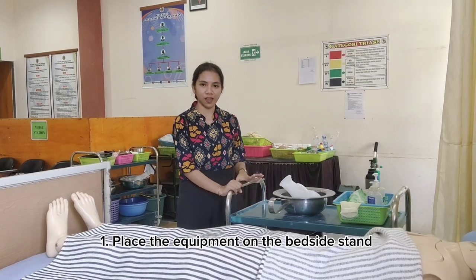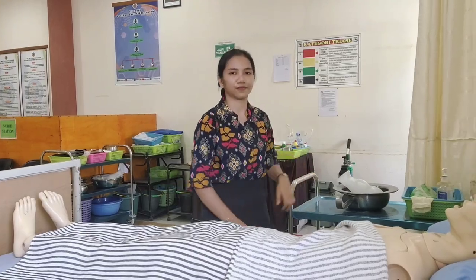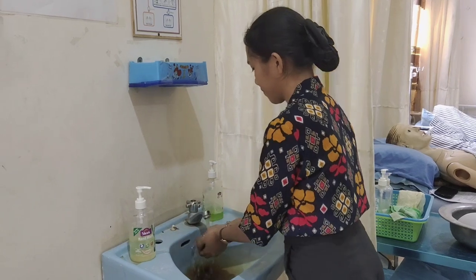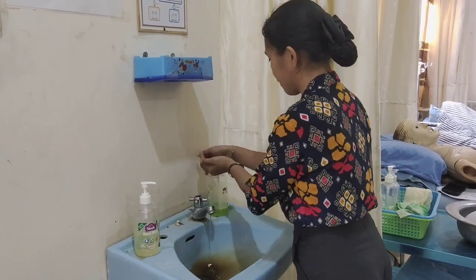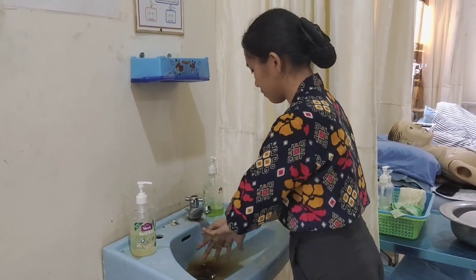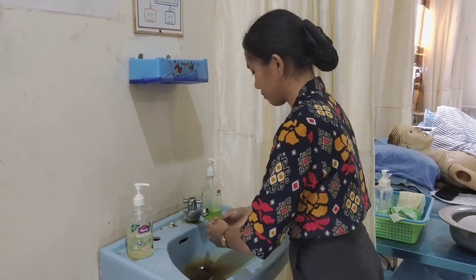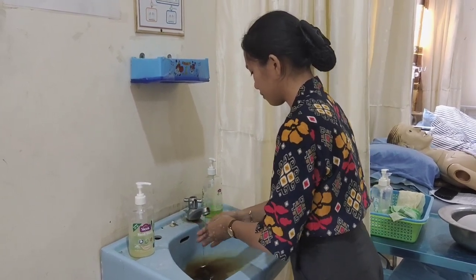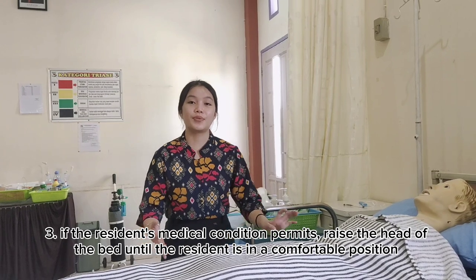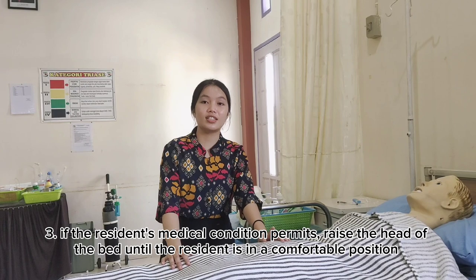Steps in the procedure. Step 1: Place the equipment on the designated stand. Step 2: Wash and dry your hands thoroughly. Step 3: If the resident's medical condition permits, keep the gown on and raise the head of the bed until the resident is in a comfortable position.